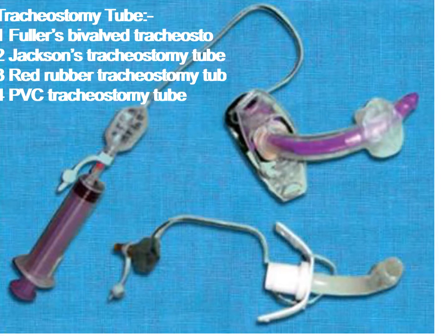Tracheostomy types. 1. Emergency tracheostomy. 2. Elective tracheostomy. Tracheostomy tube. 1. Fuller's bivalve tracheostomy tube.